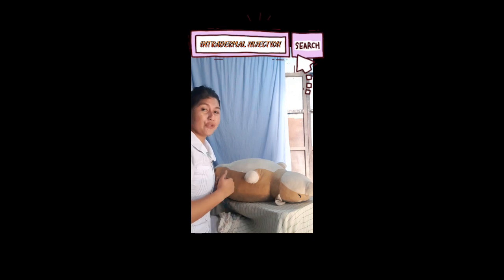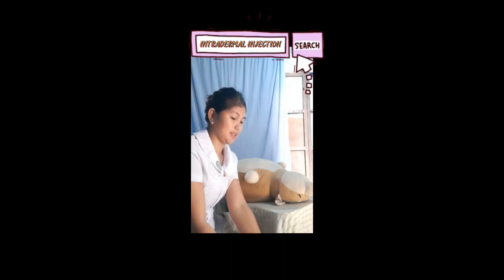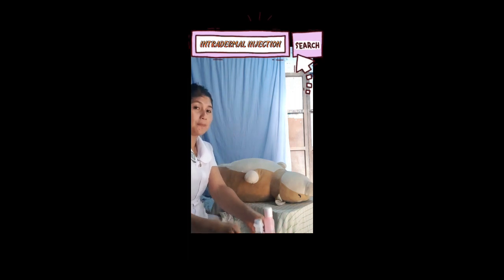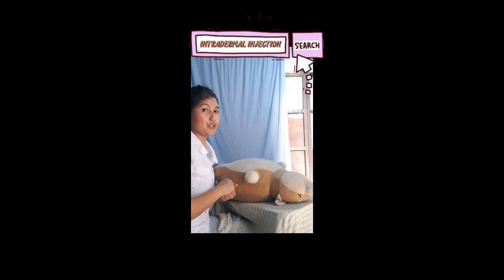So next, I will proceed. Review the medication that we are giving as ordered by the physician. Next, arrange all your equipment. So I have here all my equipment. After that, introduce yourself, verify the client's identity, and also explain the procedure to the client.